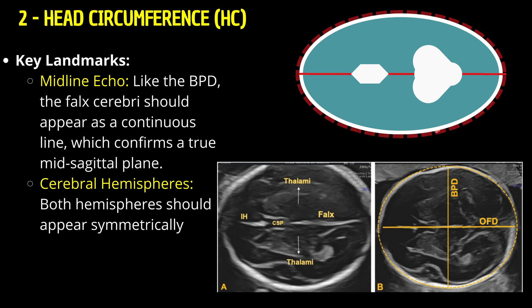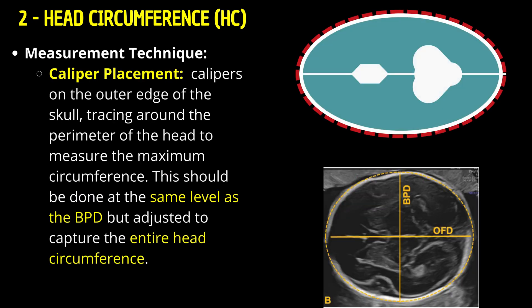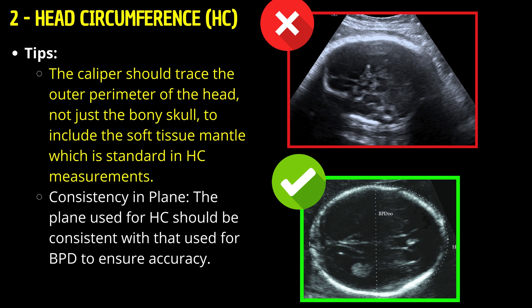Both cerebral hemispheres should appear symmetrically on either side of the falx cerebrae, confirming the probe is correctly aligned. For caliper placement, place calipers on the outer edge of the skull, tracing around the perimeter of the head to measure the maximum circumference at the same level as the BPD. The caliper should trace the outer perimeter of the head, not just the bony skull, to include the soft tissue mantle, which is standard in HC measurements. The plane used for HC should be consistent with that used for BPD to ensure accuracy.